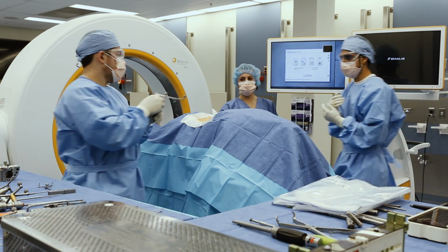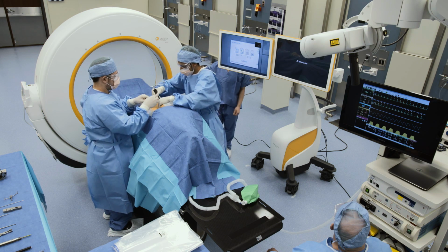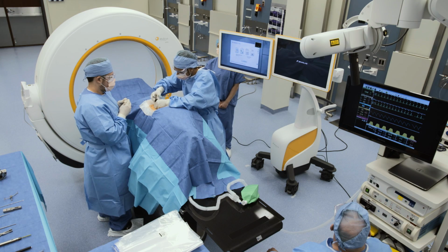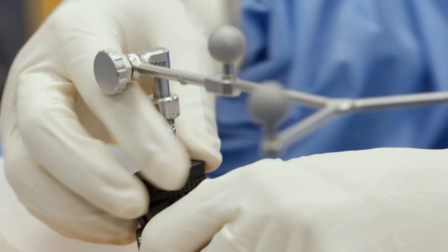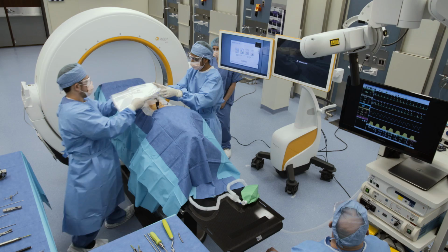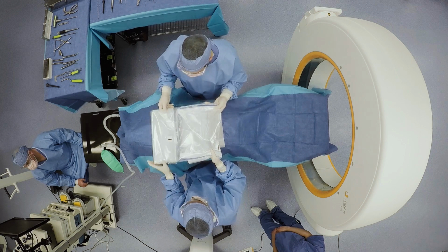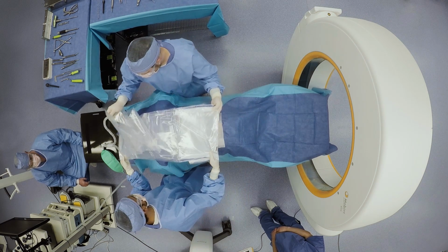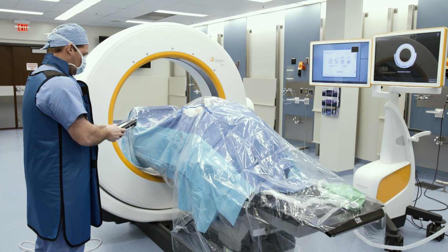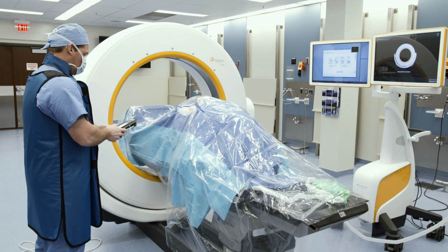If we were going to do a percutaneous case, again, we have two options. My preference is to attach the clamp to a spinous process, so I'll make a small incision, attach the clamp to that. An alternative is to place 2 pins in the iliac crest. Once the patient's prepped and draped and the clamp is attached, you're ready to scan. We then place a clear plastic drape over the patient, and we have the anesthesiologist move the table to that preset position for scanning.